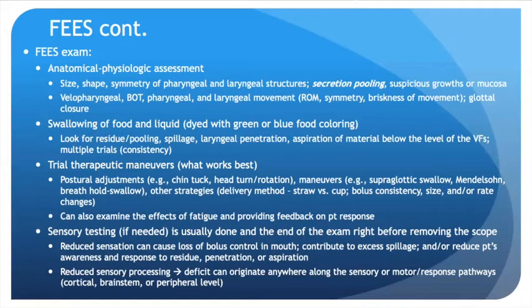So you can trial therapeutic maneuvers. You're just trying to see what works best. So postural adjustments, what about chin tuck or head turn or rotation, various maneuvers like the supraglottic swallow or Mendelsohn or Masako or the breath hold swallow. Other strategies such as changing the method of delivery, like a straw versus cup versus sippy cup. Might look at changing the bolus consistency or size or the rate of presentation. And you can also examine the effects of fatigue and provide visual feedback, where the patient can look at the screen and see what's going on with their larynx, for example. And you might perform sensory testing at the end of the exam, right before removing the scope.